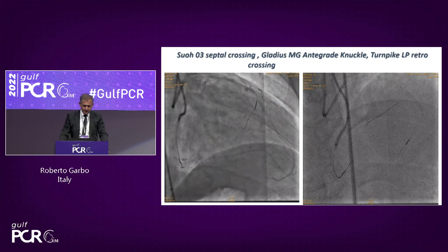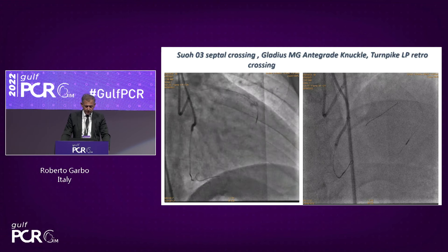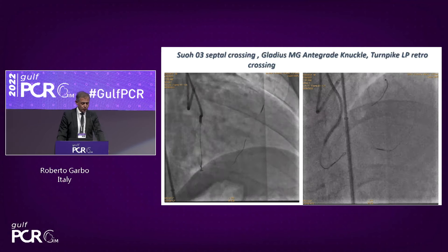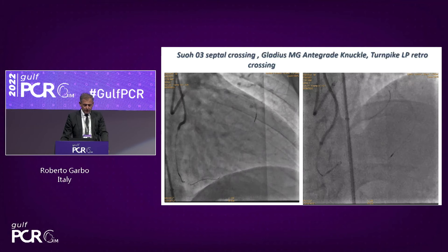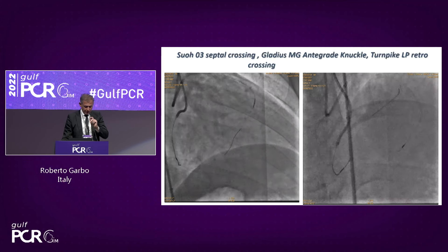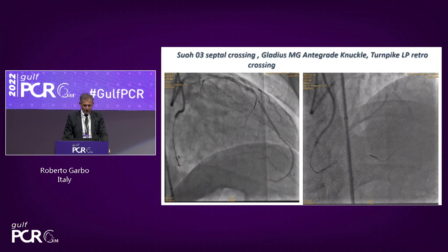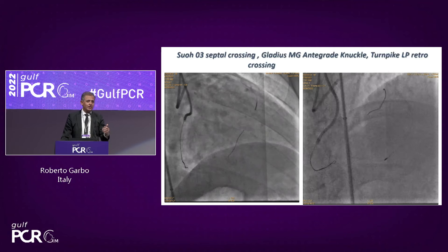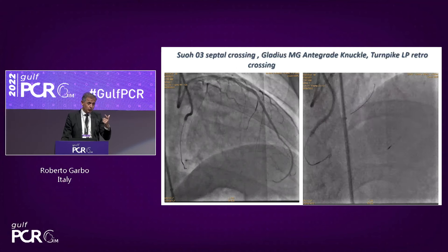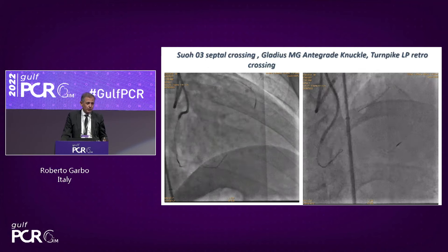I started retrograde with a very low amount of contrast — just 2 cc to understand position. The wire used was a Sion Blue (SWO 3), crossing with a Turnpike LP retrograde: Turnpike LP 150 and SWO 3. From antegrade, I started directly with the Gladius Mongo to knuckle, because we need to make the connection in the distal part of the right. We cannot do everything retrograde. I placed the antegrade wire in front of the distal crux to help the retrograde wire puncture.